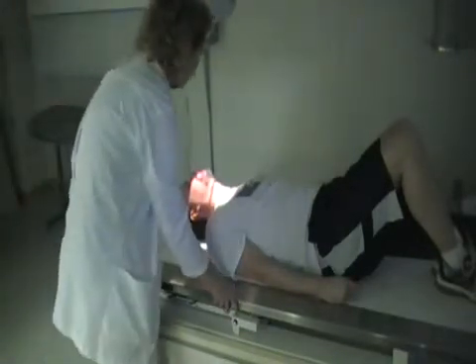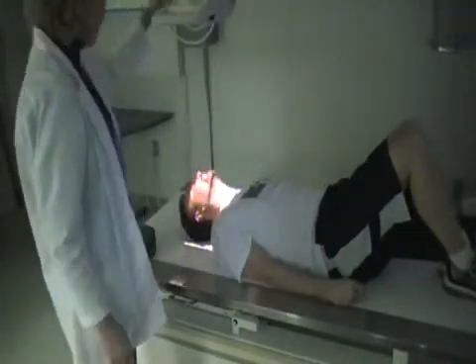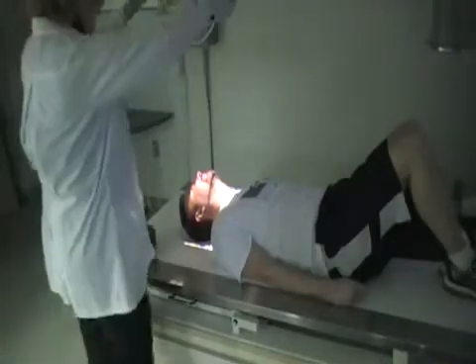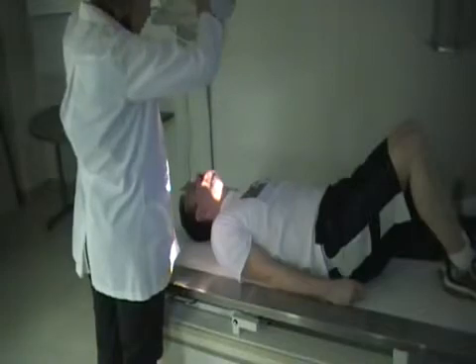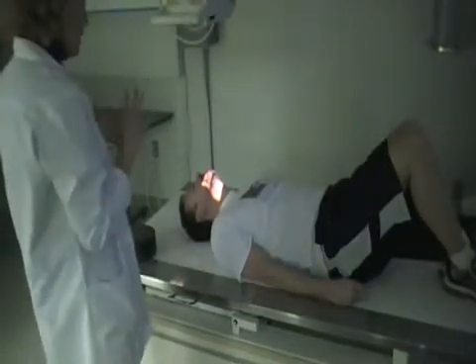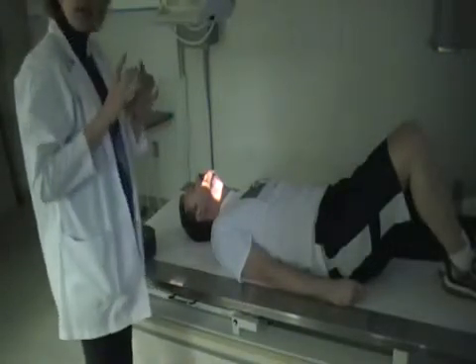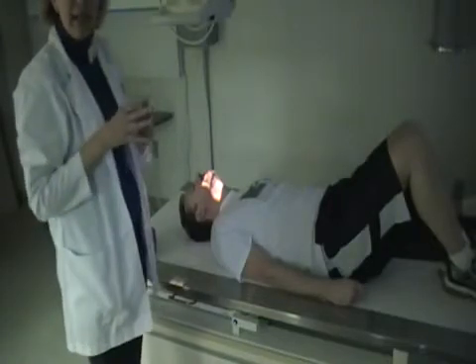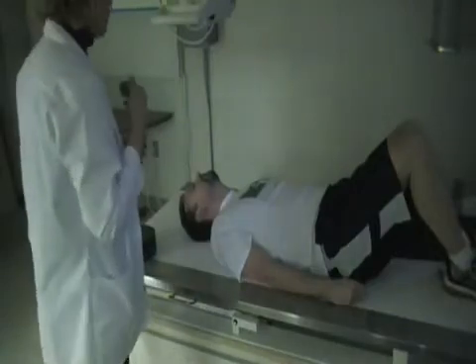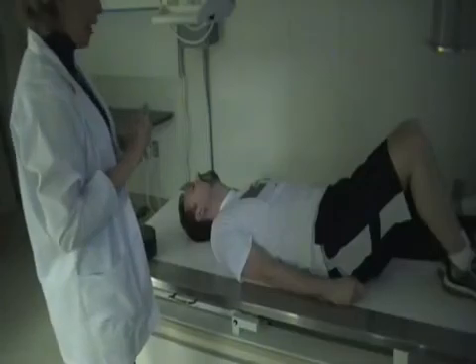Okay, next we're going to center just directly right underneath the chin. It'll look like it's just skimming the bottom portion of the chin. And then you can just collimate down, because we're only interested in seeing the dens. So when you take this image, the picture will look like the dens is shining right through the opening of the foramen magnum. So this is only needed to be done if you cannot see the dens on that open mouth. Okay, thank you.